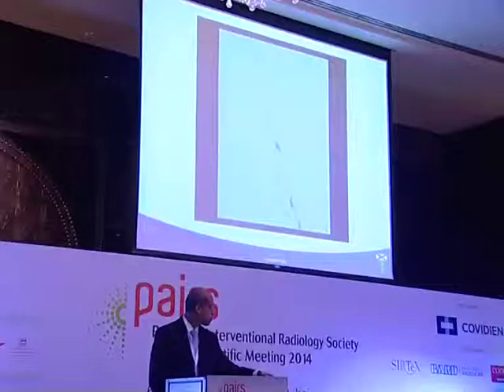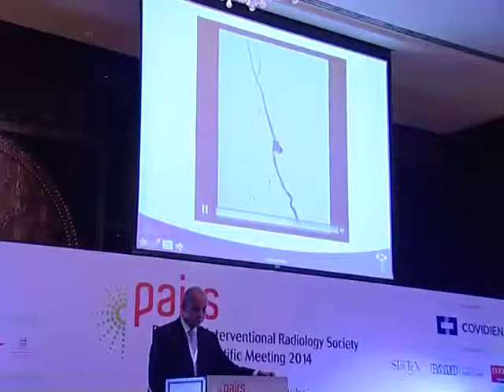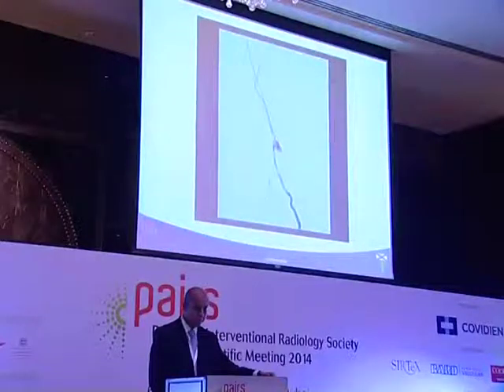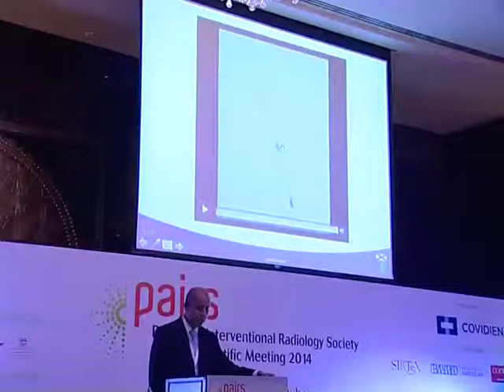So what do you think that represented? Because it wasn't present at the initial. Yeah, if I have to guess, as was alluded to before by one of the persons in the audience, it was a total subintimal angioplasty and a stent. There is probably some degree of deformity of the stent in there that led to that aneurysm formation. That was my best interpretation of it. I did do an intravascular ultrasound. There weren't any significant fractures or anything there. Could I have covered? Sure, but again, that was the rationale for not covering it.